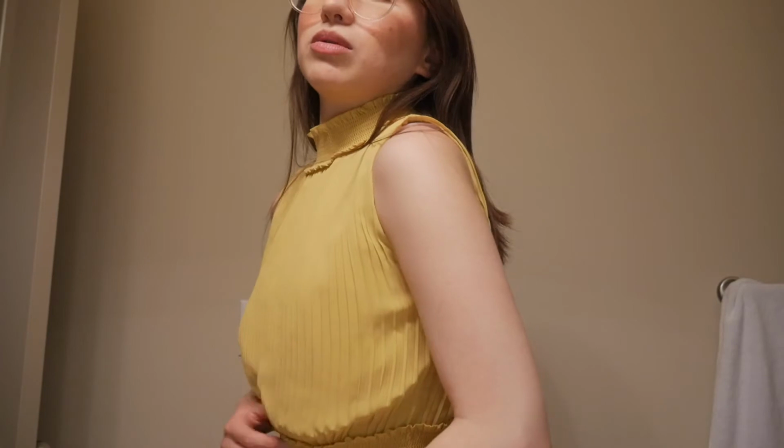What does it look like? I wanted to show you guys this. My breasts were uneven, definitely. When my implant was just filled with air, the expander, I mean, it didn't feel too hard or too heavy or anything like that. I didn't think so personally, but you can see the skin is a little shriveled, especially in the incision. And that's good because your skin's elastic, right? And then as it's growing, obviously so is your skin, eventually to get to the size that I want.